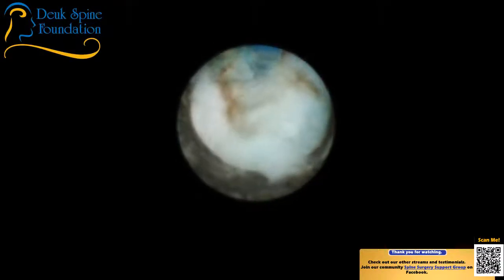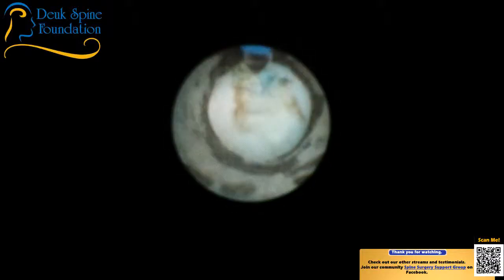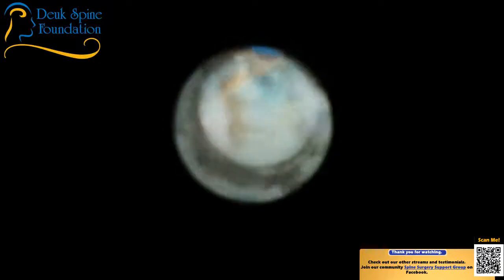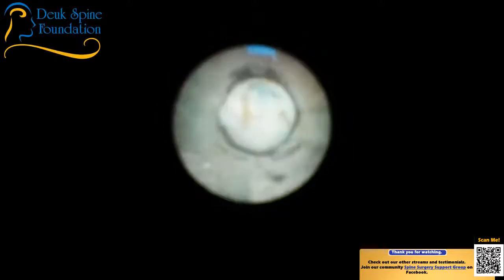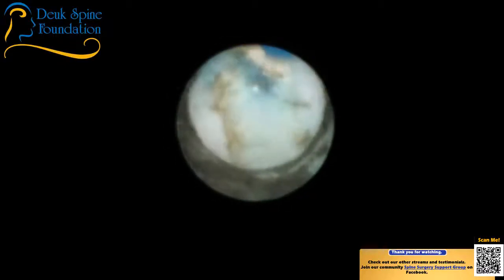I'm going to adjust my focus. I want to be careful not to go past the posterior ligament until I'm absolutely ready. And most of the time I don't need to, because most herniations, like I said last time, that are symptomatic are not past the posterior ligament. They are contained herniations, meaning that they are found on the disc side of the posterior ligament.